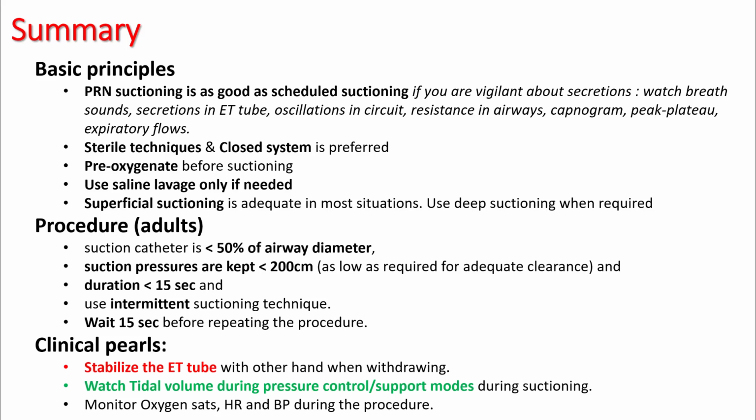Always make sure that you stabilize the endotracheal tube when withdrawing the catheter, and watch tidal volumes during pressure control and pressure support modes during suctioning. Monitor oxygen sats, heart rate, and blood pressure.